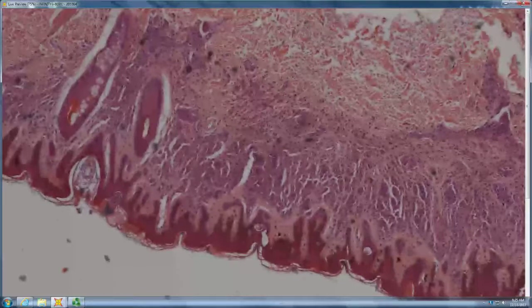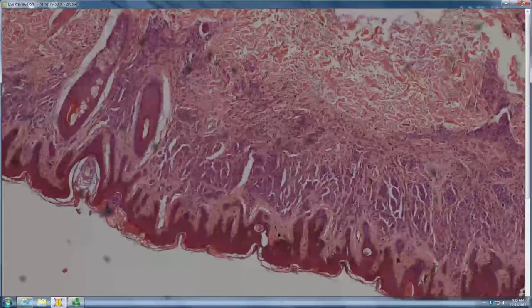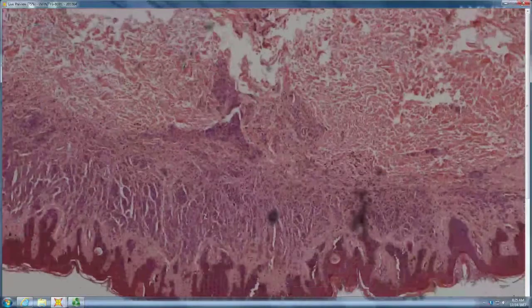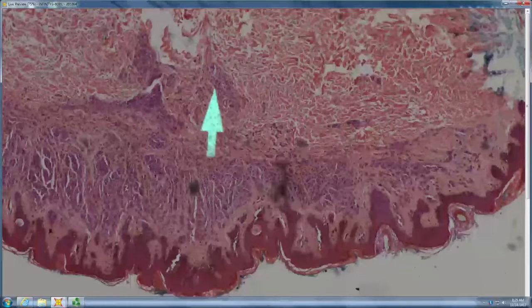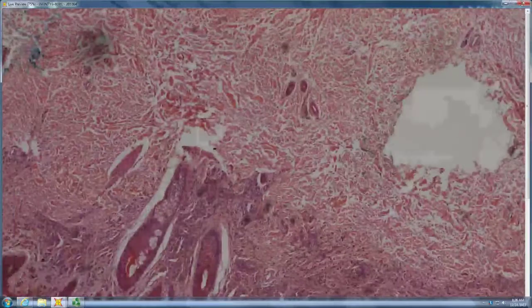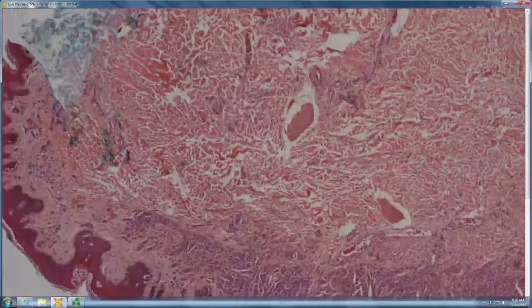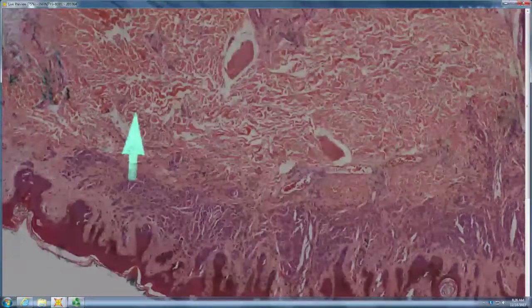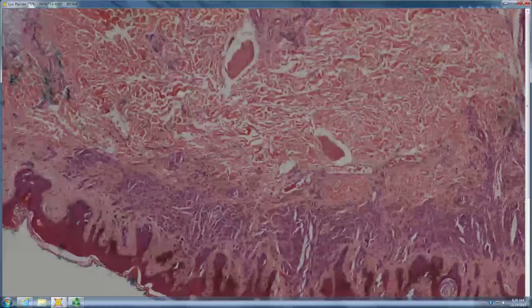So how about this one? I was wondering about some type of nevus. Some kind of nevus. And then, is it confluent or is it patchy? Patchy. A little patchy. So patchy melanocytic nevi tend to be with sort of little interstitial patchy areas, disconnected from the rest, tend to be congenital. Congenital. Congenital. Oh. Benign. That is true.